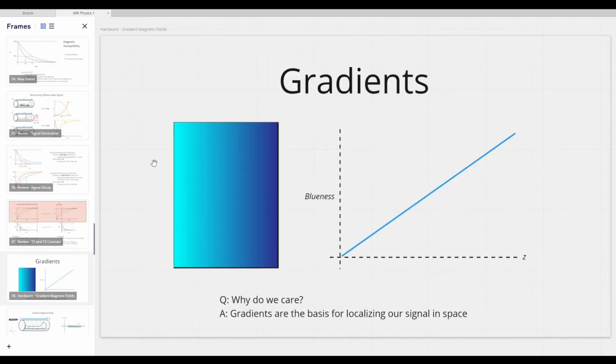Okay, so up to this point, lecture 1, we talked about magnetic resonance and what it is, how we get any signal at all that's measurable. Lecture 2 was talking about contrast, right? Differences in the way that these tissues are giving off energy after we apply our RF pulse. And we watch those curves that we just talked about, and those differences in the rate at which those curves return to baseline gives us contrast. Okay, when we acquire a signal, we can tell the difference between fat and water, muscle and water.